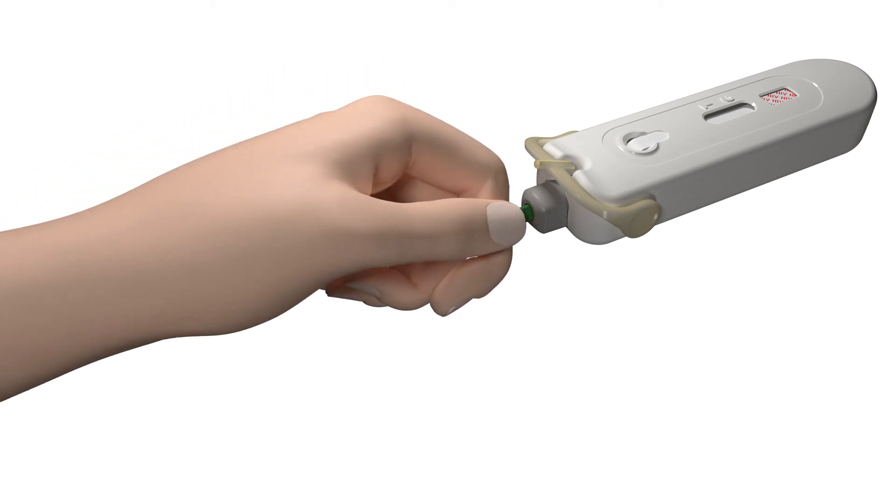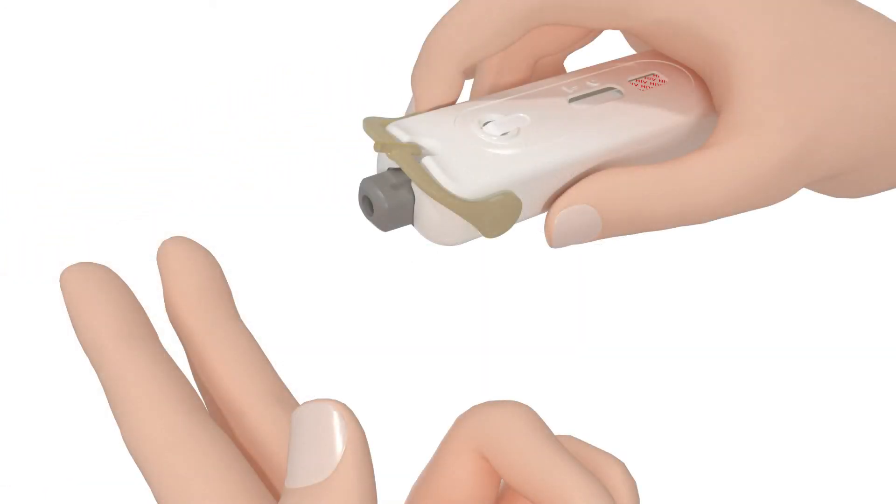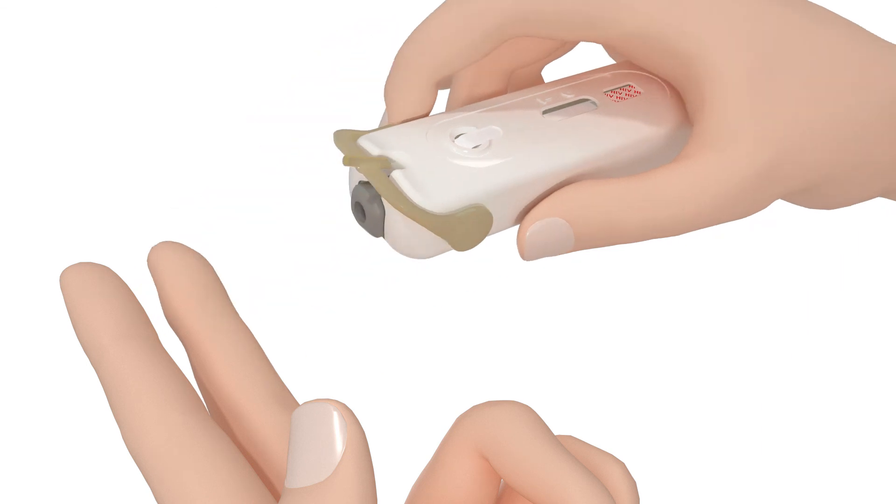Gently turn the green tab, take it out and throw it away. To prick your finger, press the grey button firmly against the side of your finger until you hear a click. It can only prick once.